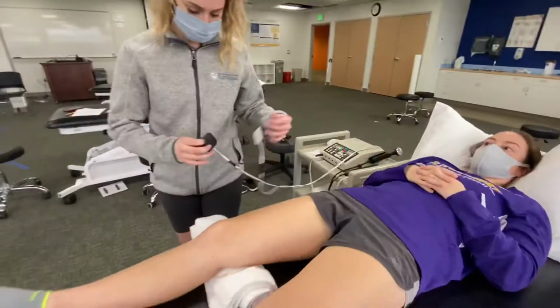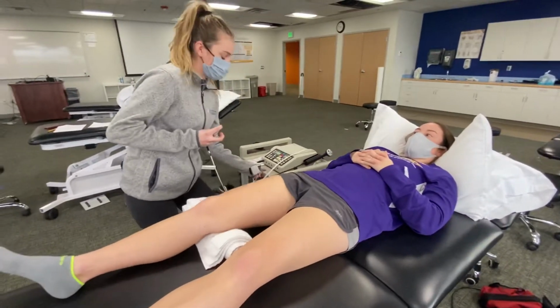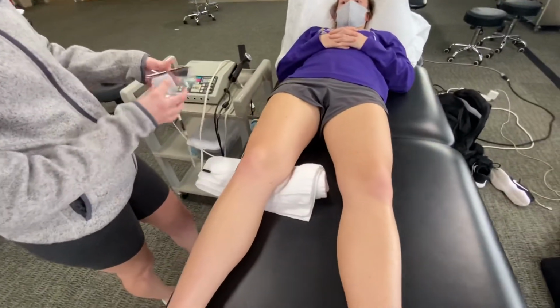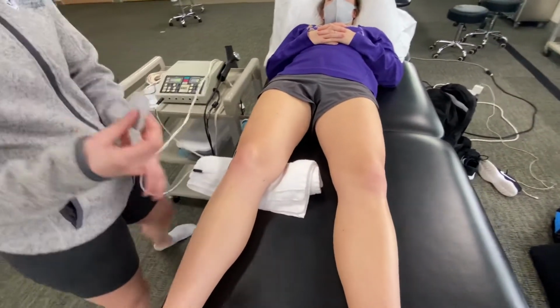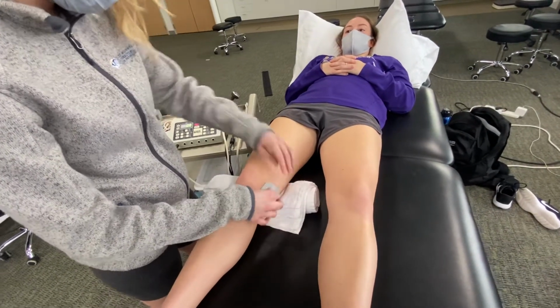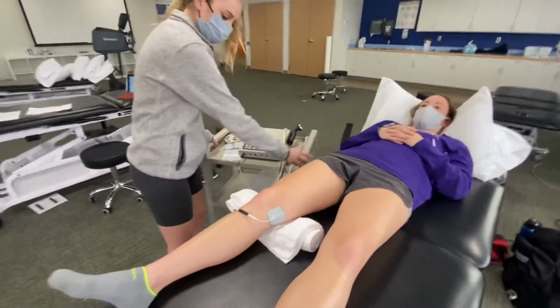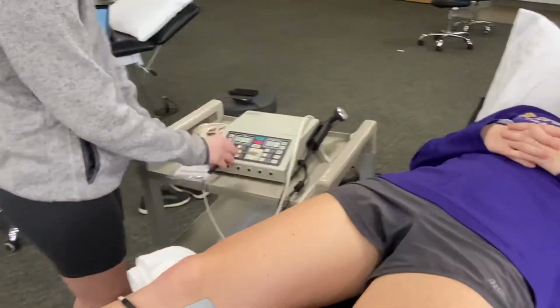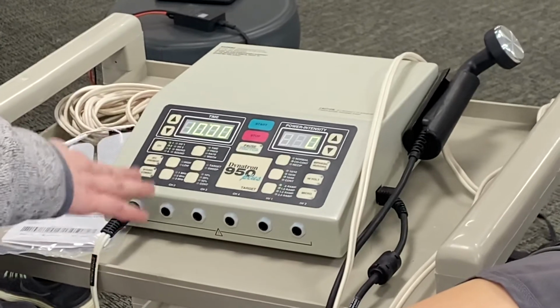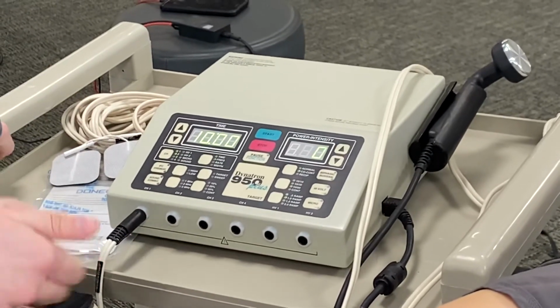So I'm going to place the pads on either side of the knee, right where the pain is. All right. And how I set this up is I make it biphasic. I'm going to leave it at 10 minutes, but normally it's going to be 30 minutes for a treatment.